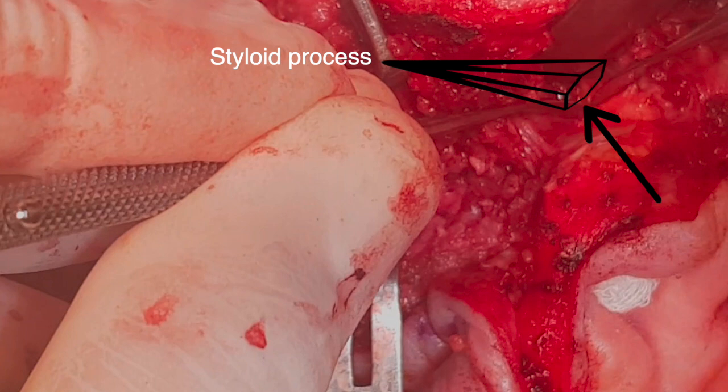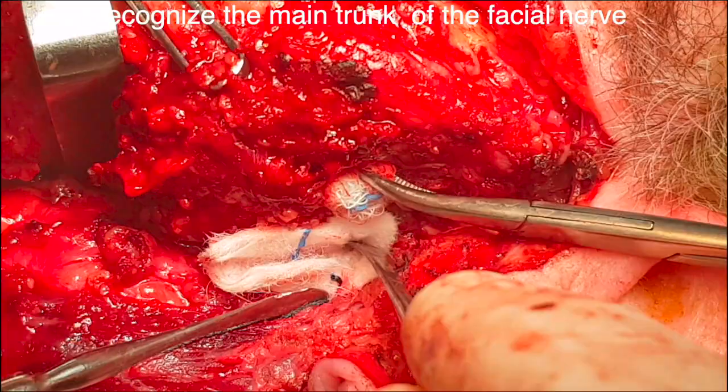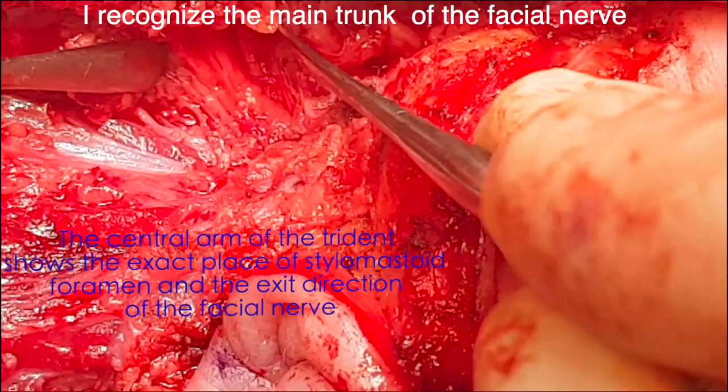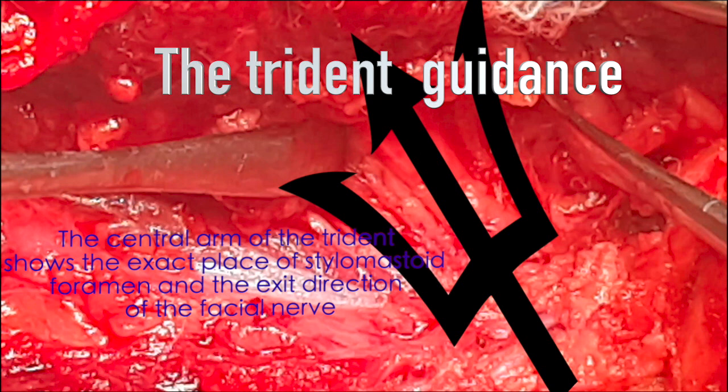And I start to envision the trident. I recognize the main trunk of the facial nerve. The central arm of the trident shows the exact place of the stylomastoid foramen and the exit direction of the facial nerve. The trident guidance.